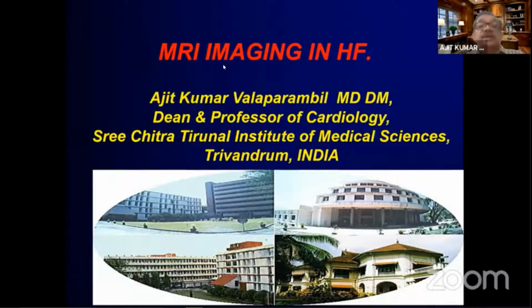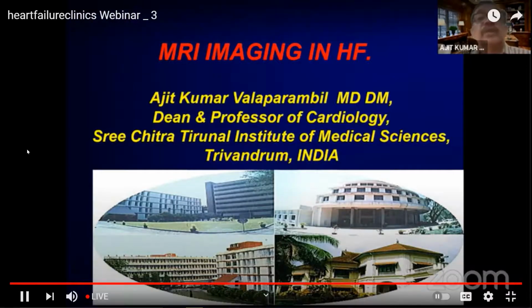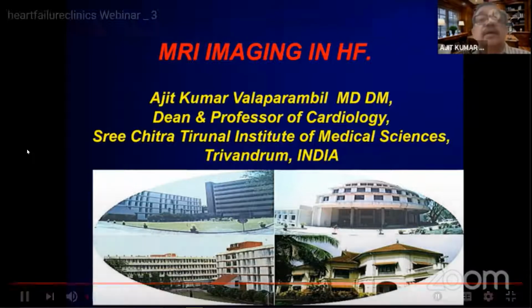The topic is MRI imaging in heart failure. I think one of the most important aspects of heart failure diagnostic assessment has been MRI ever since it began. Probably we joined the bandwagon quite early, and we have a very dedicated team of cardiac MRI imaging group. We have combined discussions almost every week, and it is routine for us to do MRI imaging in all patients with cardiomyopathy.